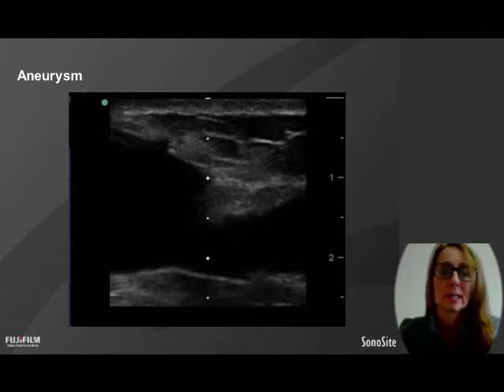The reason why we captured this image was that the staff were being very good and trying to move their cannulation spots, and because the vessel was quite deep in some areas, they'd been puncturing the aneurysmal bit and wanted to move a little bit higher up, and punctured assuming that that would also be shallow, but were just not able to hit the vessel and weren't really sure what was going on.